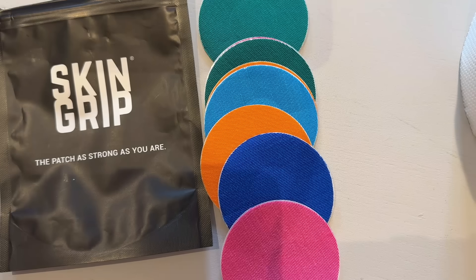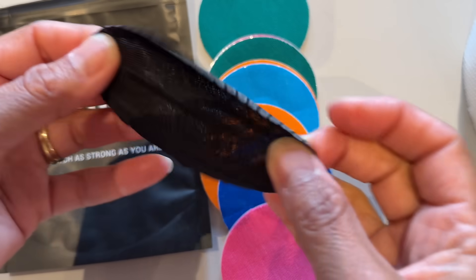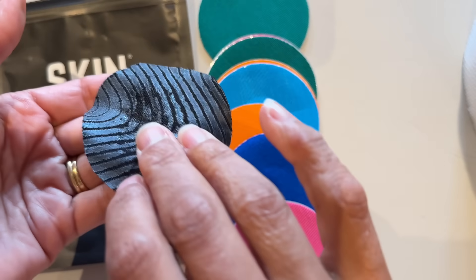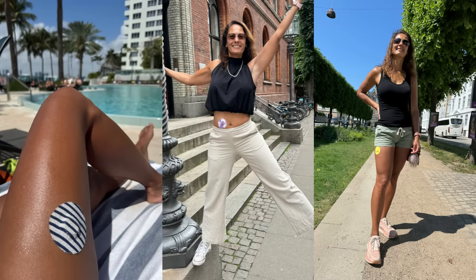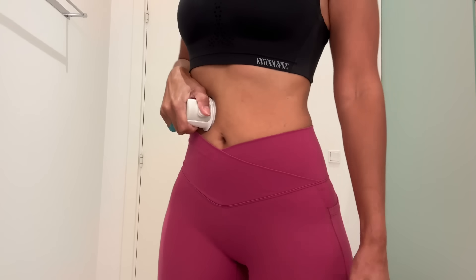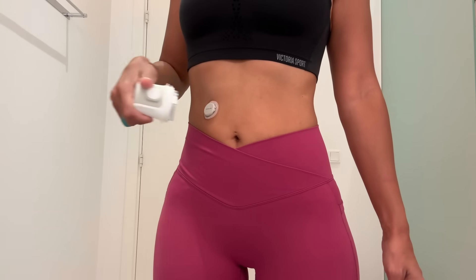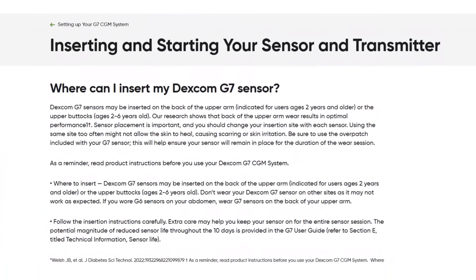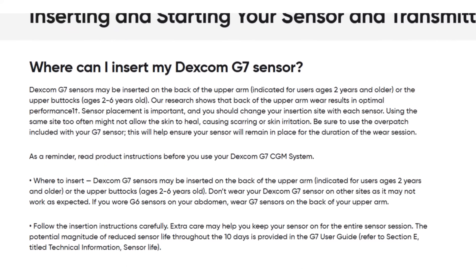Instead, I use the SkinGrip overlay tape, which I find works much more effectively. It's a soft fabric material, easy to apply and remove, and it really secures the sensor without causing hives. Another option is to add Skintac adhesive underneath your sensor — just apply a little to your skin, let it dry out, and then apply the sensor on top. And my favorite solution: I wear it somewhere where it doesn't get caught on clothing or door frames, which for me is usually on my abdomen. That's an off-label placement, but it works really well for me.